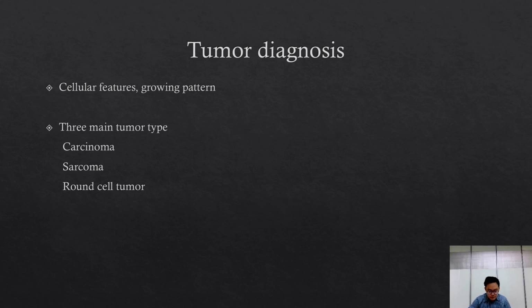Cells that form carcinomas often will grow in little islands and nests, like squamous cell carcinoma, in which the epithelial cells replicate in a dysplastic way that would not happen in normal biology.